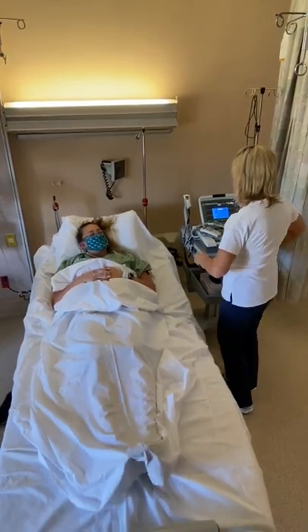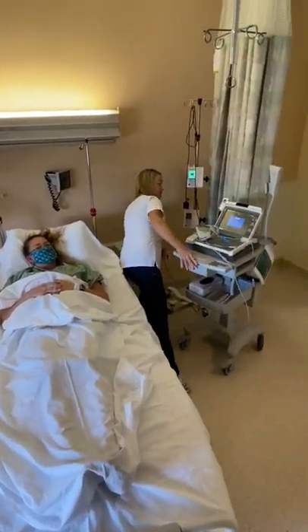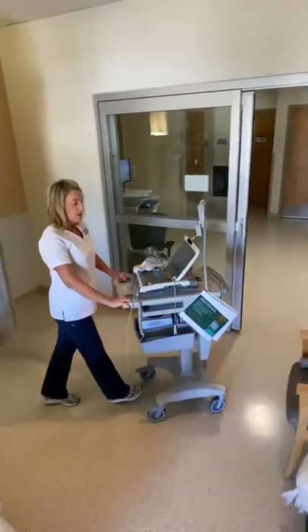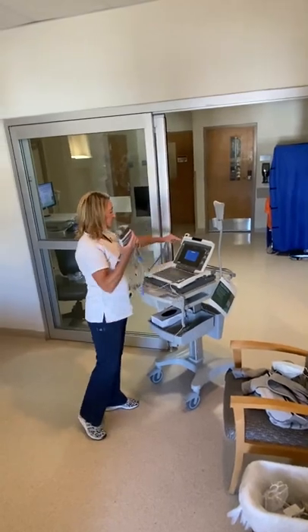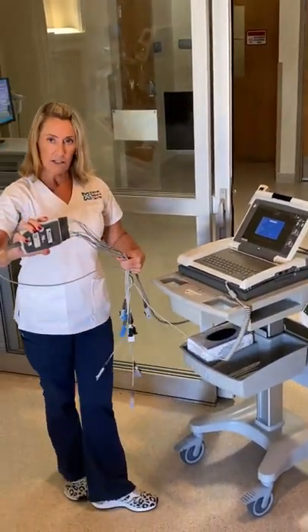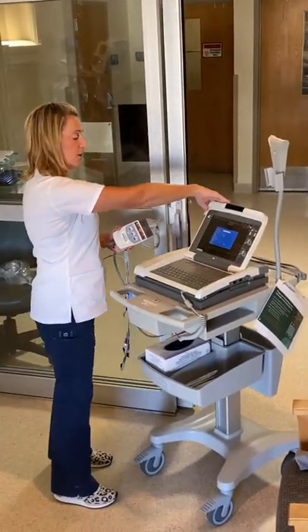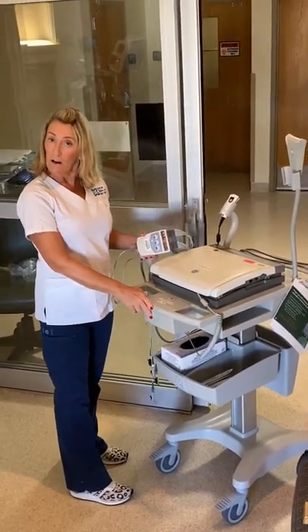Thank you so much. When we leave the room with our EKG, it is our responsibility to clean the EKG. Gray top wipes for the scanner, for the box, for all the leads, for the handles, for the keyboard, for the top. And that concludes our EKG.